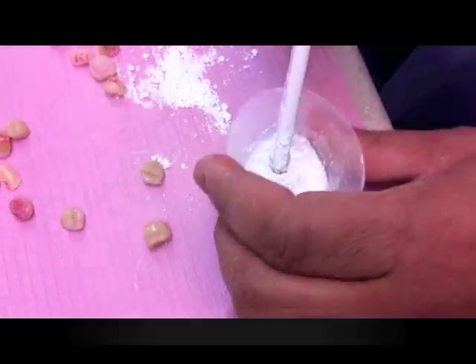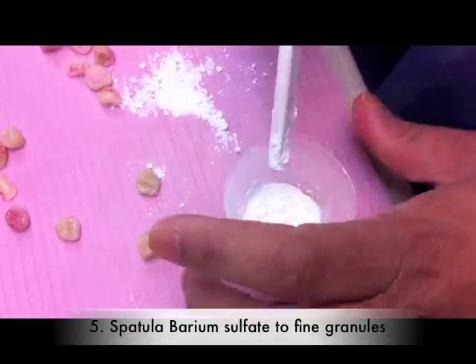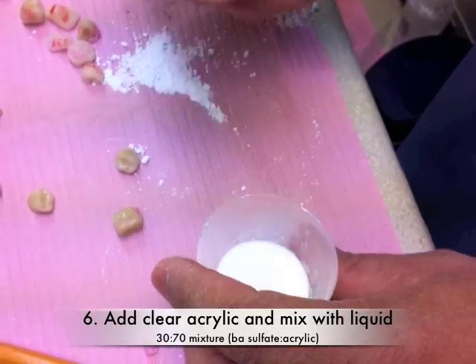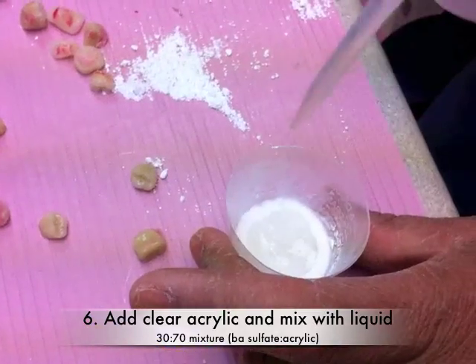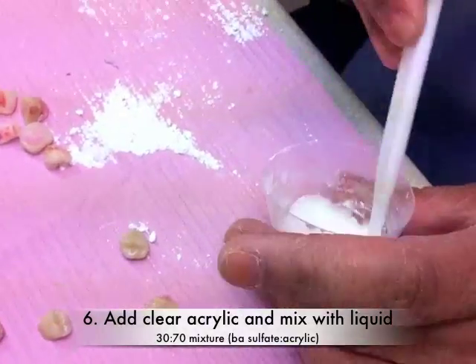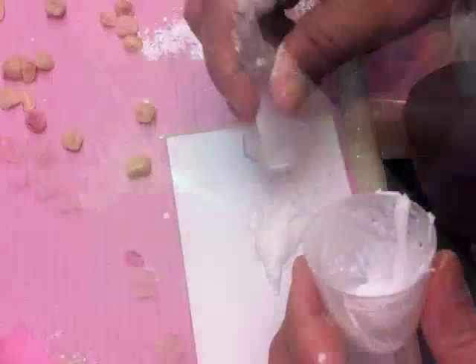Barium sulfate comes in various granular sizes, so it's best to break it up and make it as fine as possible. Then, mix the barium sulfate with clear orthodontic acrylic, ideally to a 30-70% ratio, and mix with liquid until it reaches a flowable state.